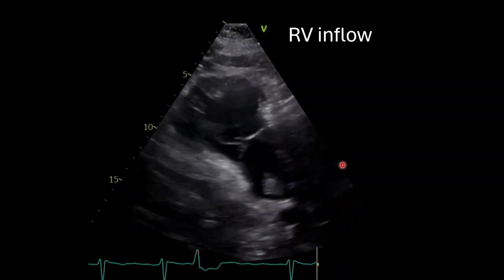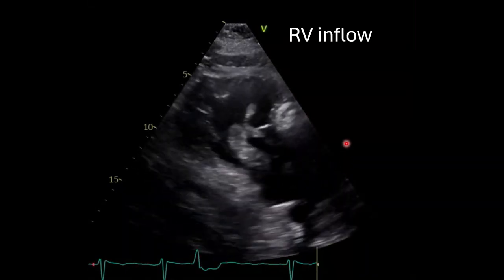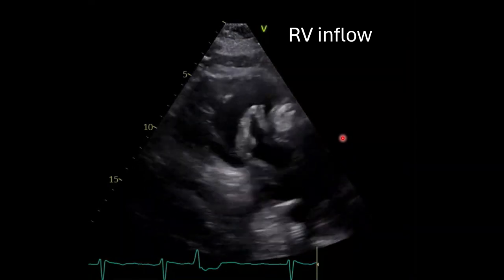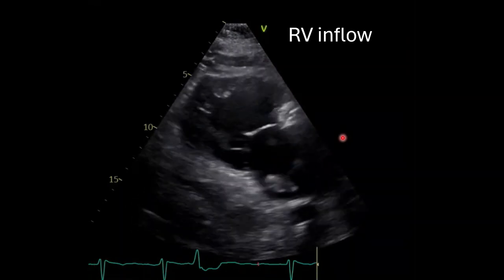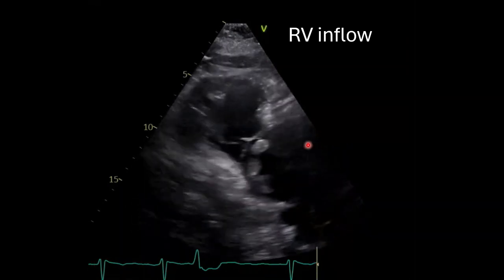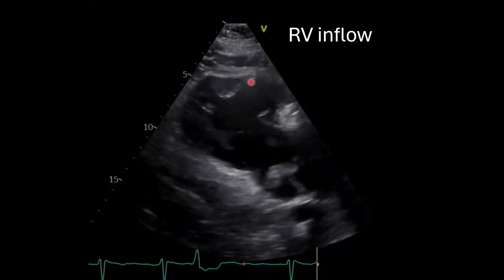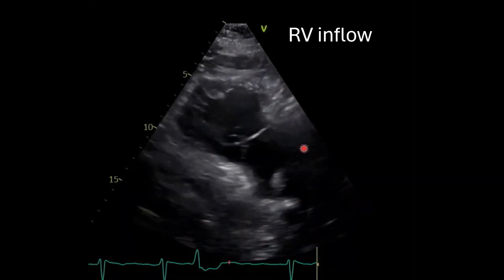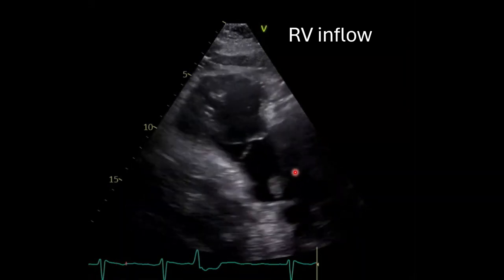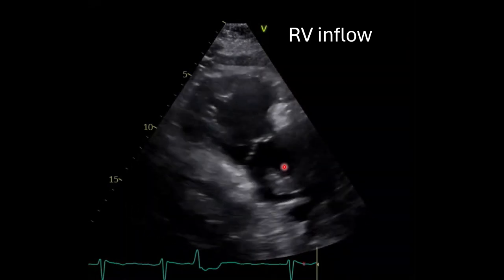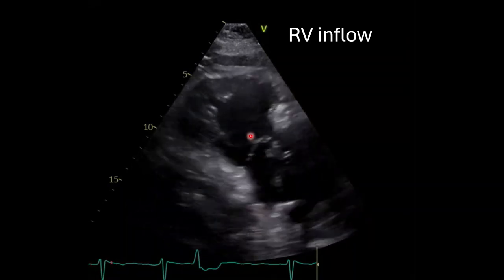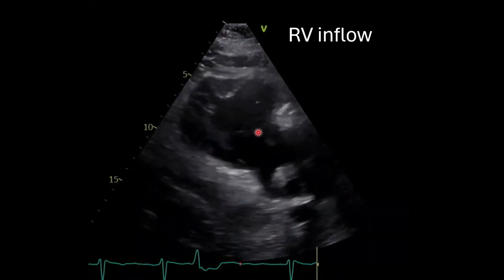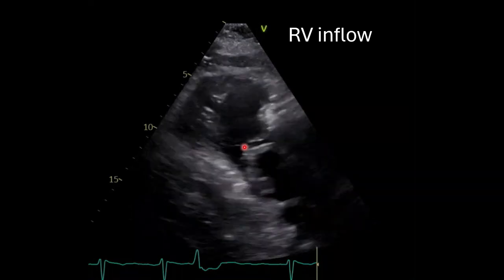We'll move to the RV inflow view. This view is not commonly used, but if you're in the parasternal long axis view, you can tilt the tail of your probe upwards to view the RV. Here's the RV, the tricuspid valve, and right atrium. You'll notice there's an echogenic mass within the right atrium that seems to be moving through the tricuspid valve but then coming back. It doesn't appear to be attached to the valves either.